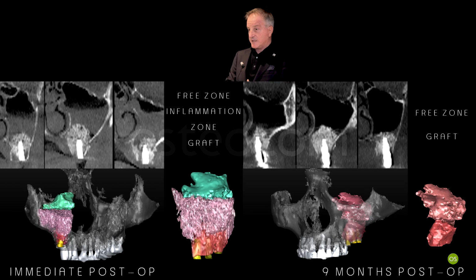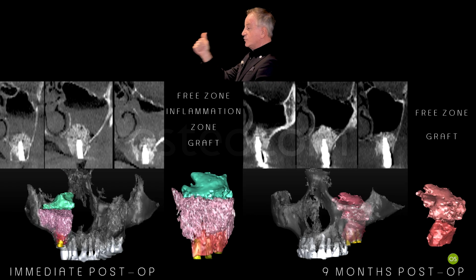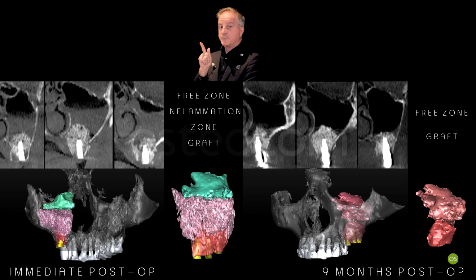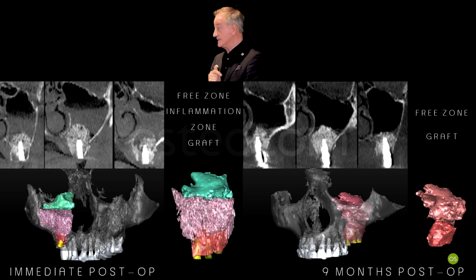So every time you do a sinus lift, you can have some kind of opacification inside the sinus that is due to, for example, mucus, small perforation and some saline gets inside the sinus, but without symptom and sign, just wait.